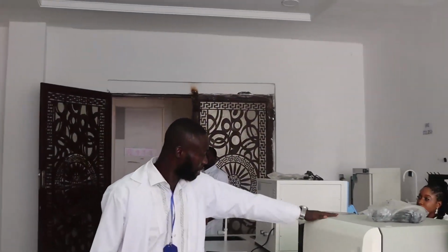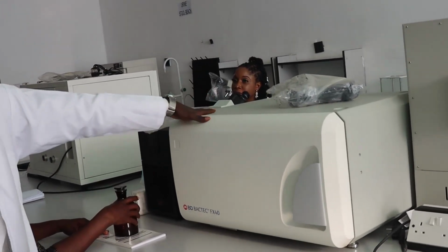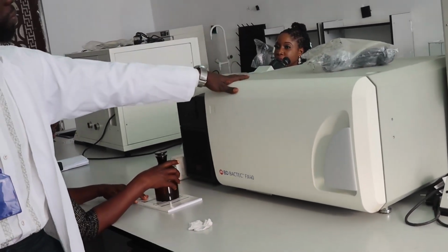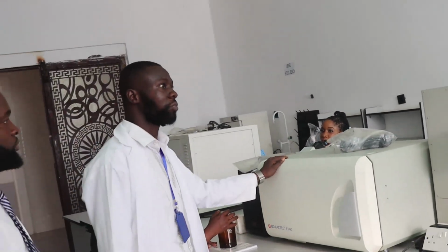Microbiology is majorly used for blood culture. This is where we are able to diagnose certain organisms in the blood. So it's part of the things we use here.